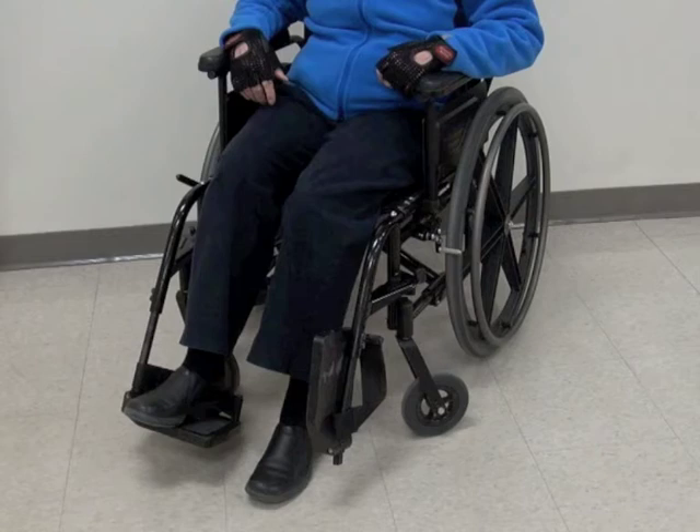Flipping up the footplate allows you to place your foot on the floor without having to move the entire footrest mechanism. However, it does not provide as much open space for you to move, and you should be careful not to catch your foot, especially if you are getting out of the wheelchair.